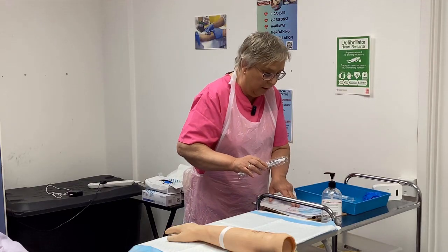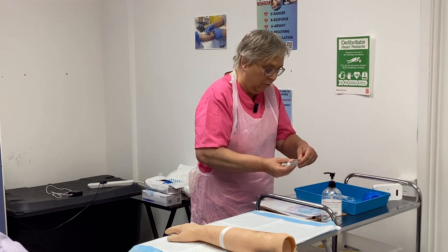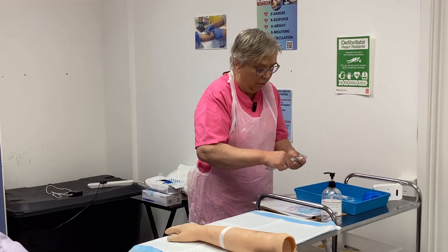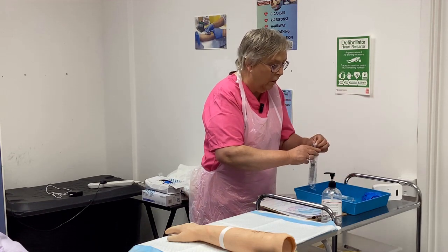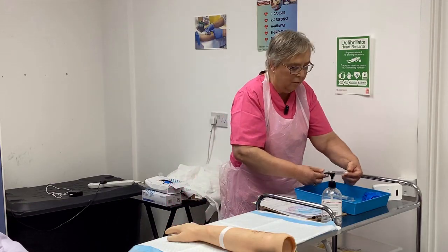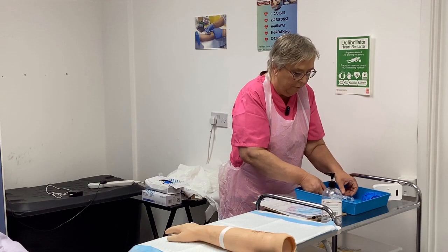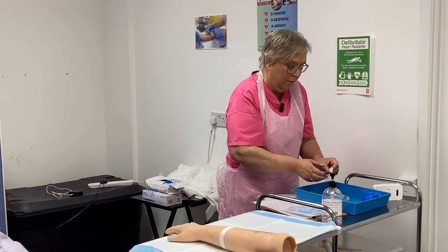0.9% sodium chloride IV. I'm looking at my medication, and it is sodium chloride. Expires 2027. So it's intact, and packaging's intact. I can then open my packaging, and it's got a bung on the end there, and I'm going to use 5ml of this infusion. I've then got a mediswab. Expires 2024.